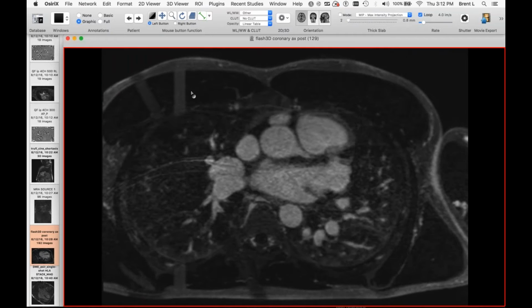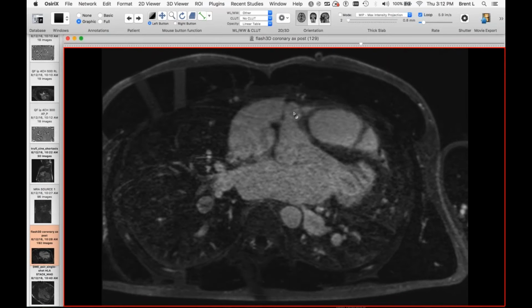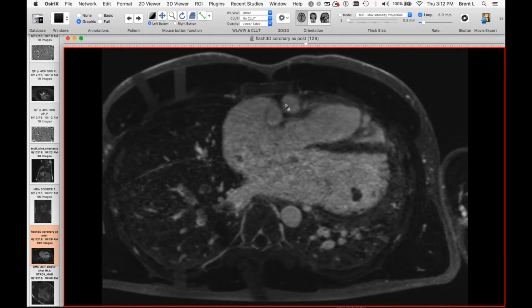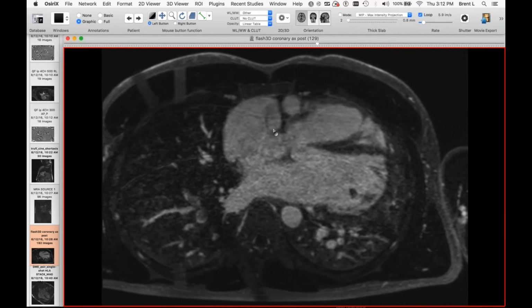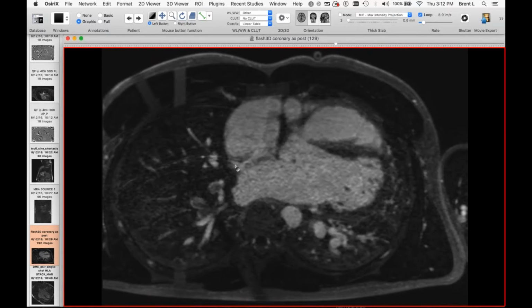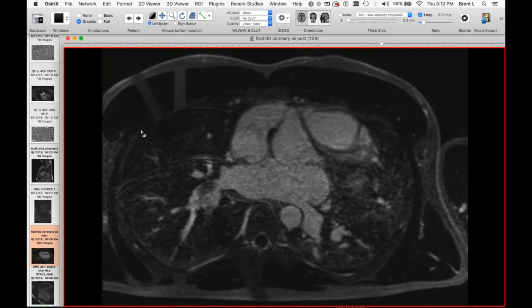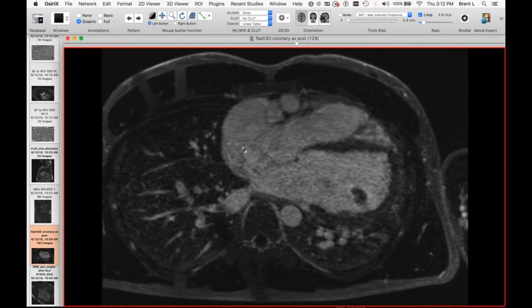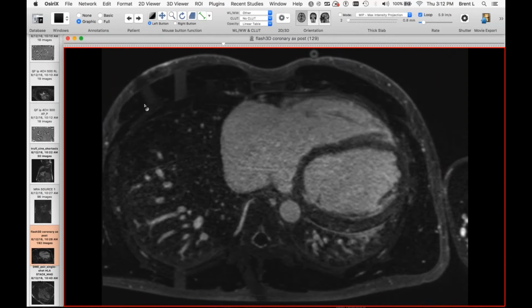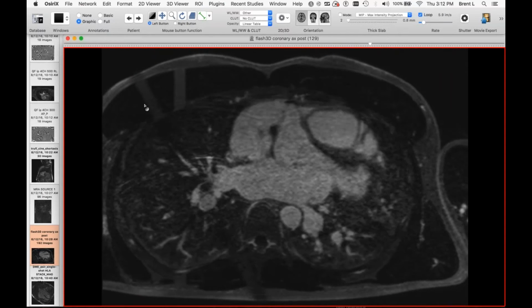Let me just cut to the coronary MRA here, and let me show you that scrolling down from the aortic root, you can see that there's an abnormal, very abnormal proximal RCA there, and we'll follow that around. There's a huge vessel that's coming off there, and it's winding around here, and comes back down, and then drains into the right atrium. So this is a big fistula, presumably from the SA nodal branch coming off of the RCA that is causing all of that artifact right in this location. There's no mass there, but just a big RCA SA nodal branch fistula draining into the right atrium.